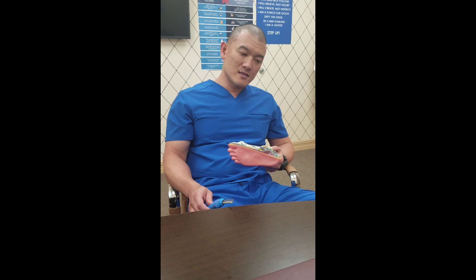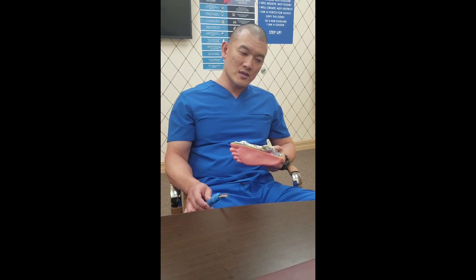But there's exciting technology that I want to share with you today, and I have testimonials of 2 patients who are 2 weeks post-op right after this video. It's something called hydrosurgery. What is hydrosurgery? Hydrosurgery is using ultrasound as well as water, or saline, to differentiate bad tissue and selectively suck out the bad tissue from the heel.